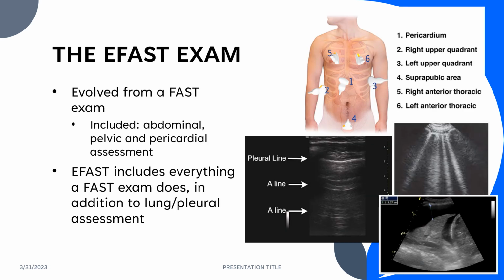So the EFAST exam, what exactly are we doing here? You can utilize a number of different scanning approaches to do your EFAST exam. A lot of physicians in the field, or your sites might have purchased for you, or you can purchase yourself, very mobile devices that you can keep in the emergency room or clinic setting, and you can sometimes have a wireless ultrasound transducer linked with your iPhone, iPad, or other devices. And then there are also a lot of laptop-type systems on the market that are really mobile and might be very useful to stay in your emergency department.